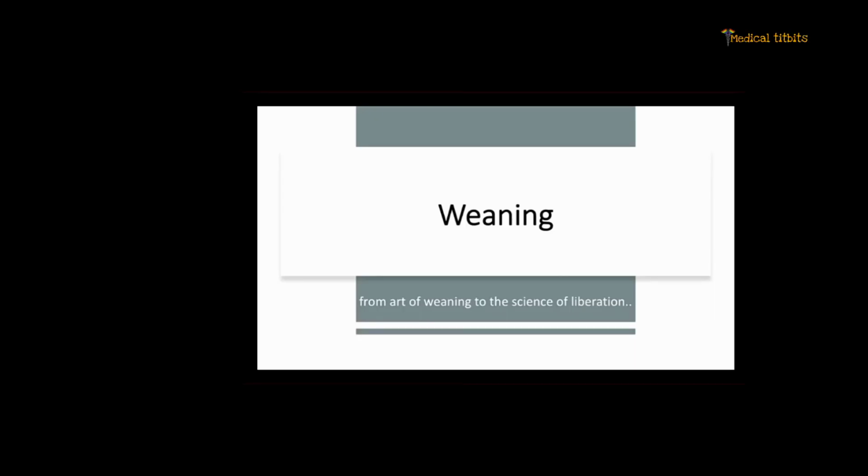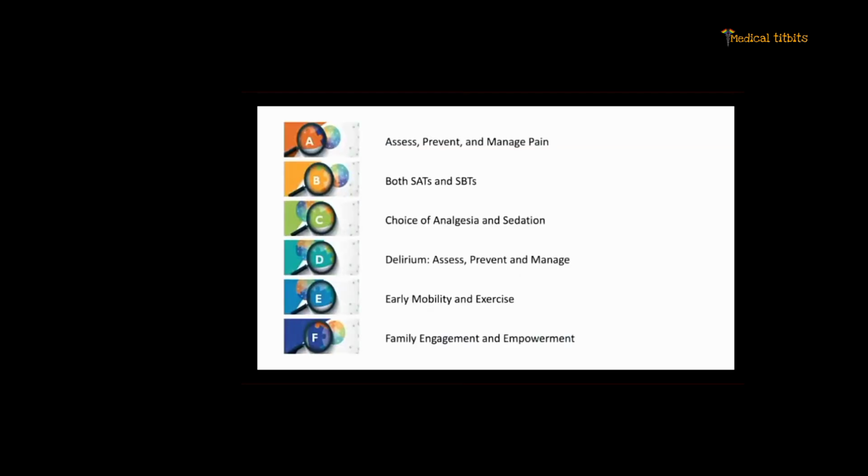So weaning is a form of art, and it is the science of liberation too. In intensive care practice, we take care of the A, B, C, D, E, F bundle. Pain management is definitely there. Spontaneous awakening trial and spontaneous breathing trials are there, which we'll discuss further.